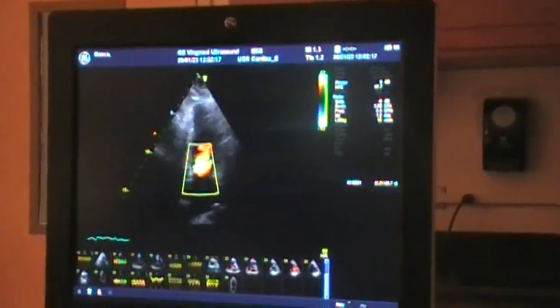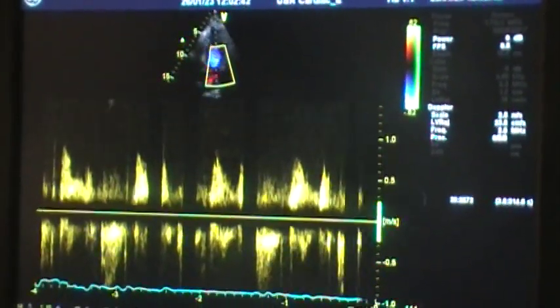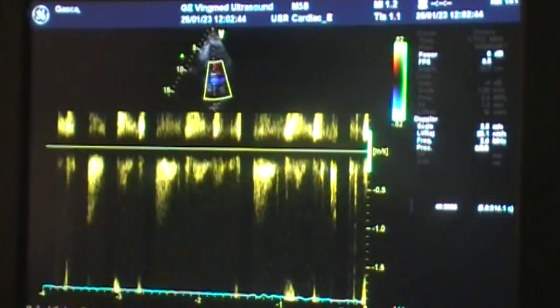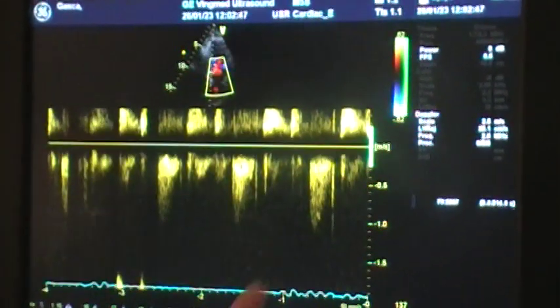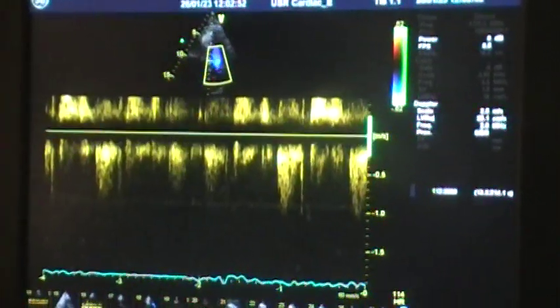You're going to put color on your mitral again. Some places will remeasure that mitral inflow like we did a minute ago. So you would do pulse wave, and you're going to get your normal flow, your E and your A with the decel time. And then you can also do continuous wave again here, looking for MR, which would be below the baseline. I'm not seeing any. I'm still picking up some of that LVOT flow there. Right there might be a little touch of MR, but not enough to measure.